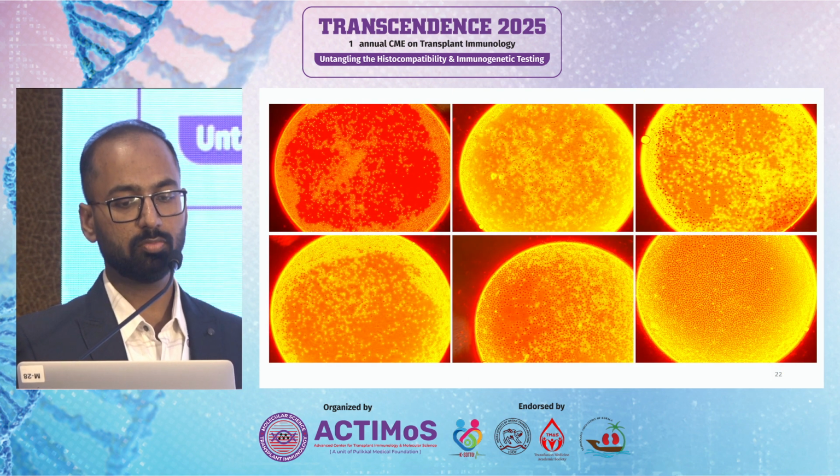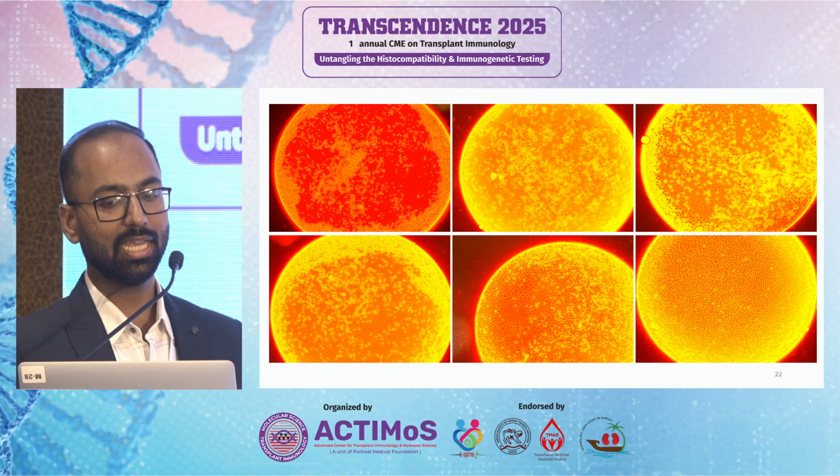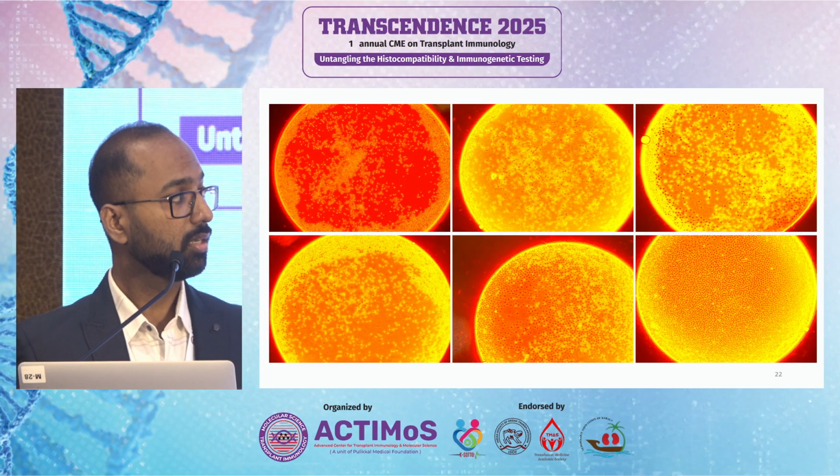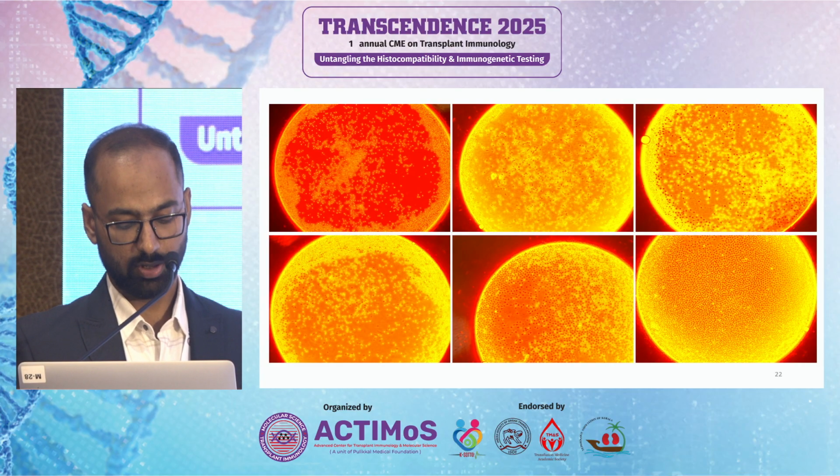So this is a range of pictures. On the top left portion, you can see a case that is clean negative, and on the bottom right portion, you can see a case that is fully positive, with full dead cells.